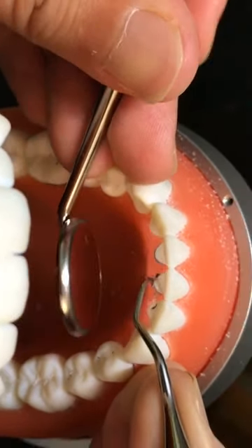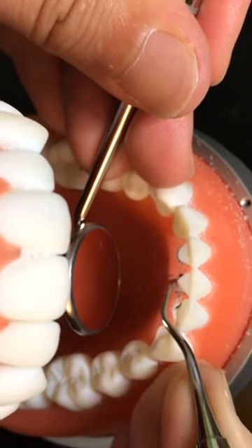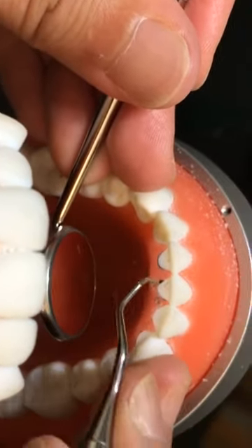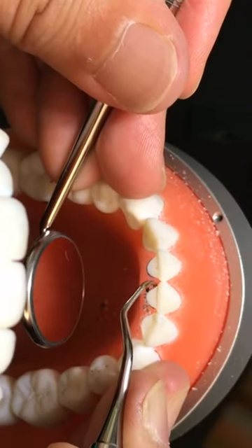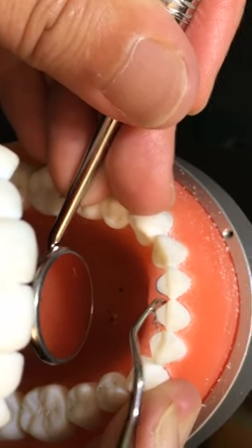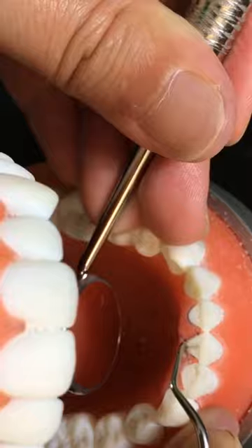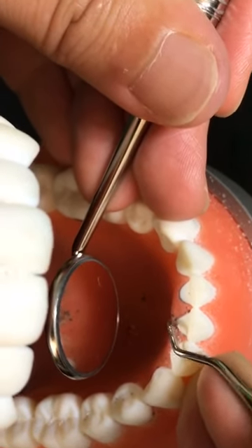The mouth mirror is reflecting the light. Doing this through the camera is really tough. Straight lingual will be like this, but for more towards the surface away from you, you have to angulate — angulate like this — then it will be parallel to that surface. This angulation is very pronounced, more pointy in a way, for the anterior teeth, because the cross-sectional shape is oval. For anterior teeth, your terminal shank must be adapted throughout this angular area, and you're going to change your angulation.